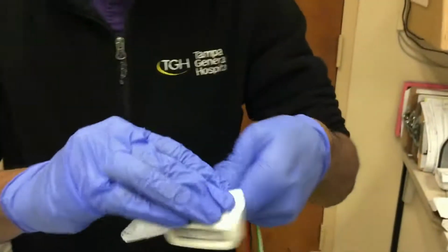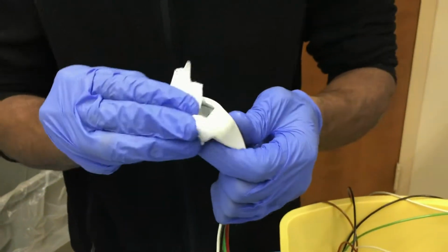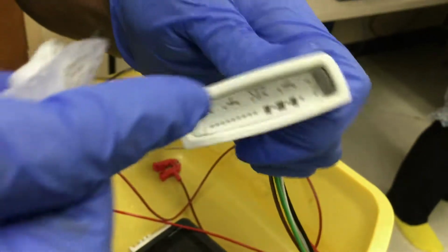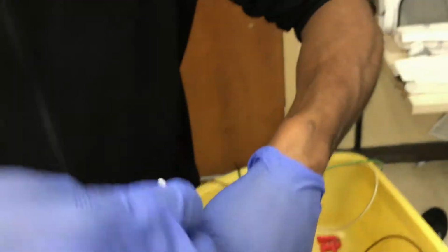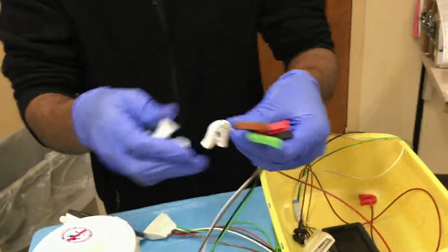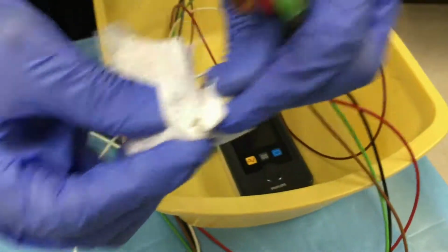Your next step will then be to wipe around the connection piece of the lead set. Avoid wiping on the inside of this piece of the equipment unless you see that it is visibly soiled. This is because the harshness of the Cavicide wipes can cause essential components to corrode. Now, you are ready to clean the connecting pieces of the chest leads.